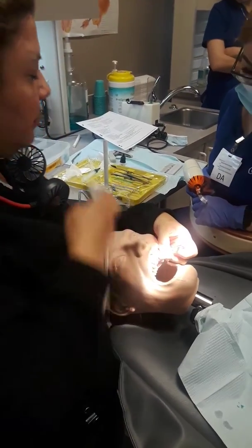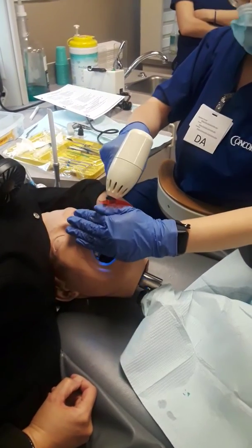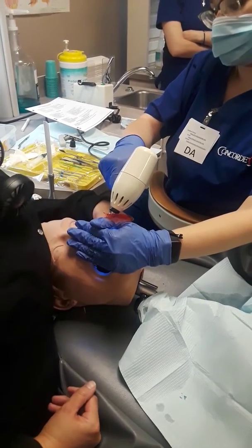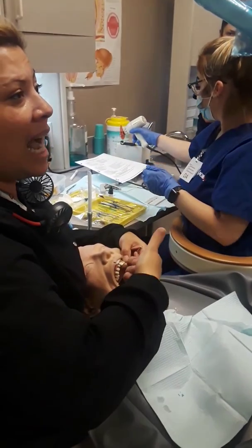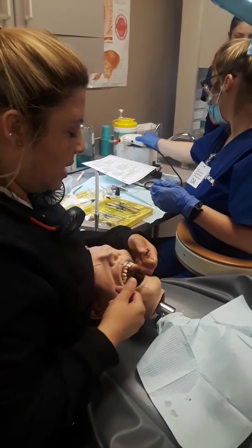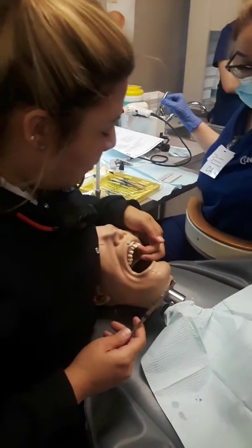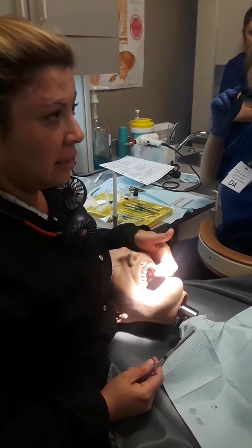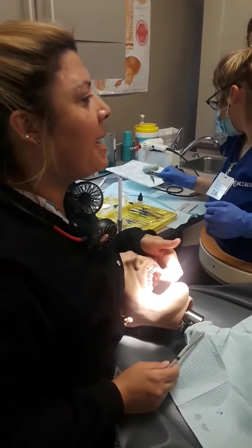She's going to cure — how long? Twenty seconds. Click in the mouth, click out — on and off inside the mouth. Twenty seconds. I am forcefully holding my lingual as tight as I can because if material escapes through the lingual, my whole filling will be messed up.